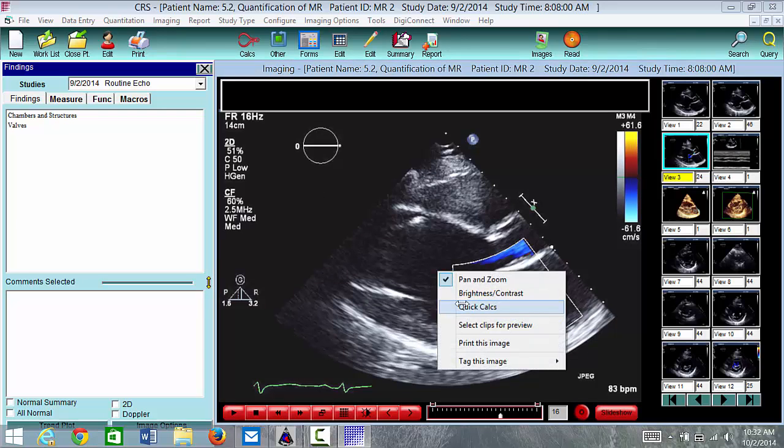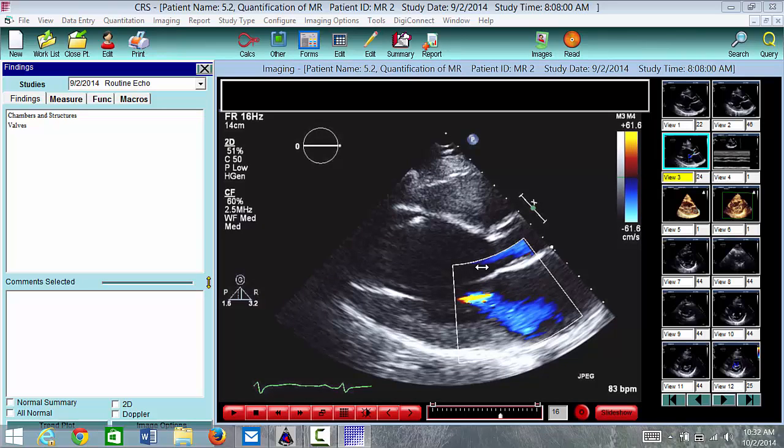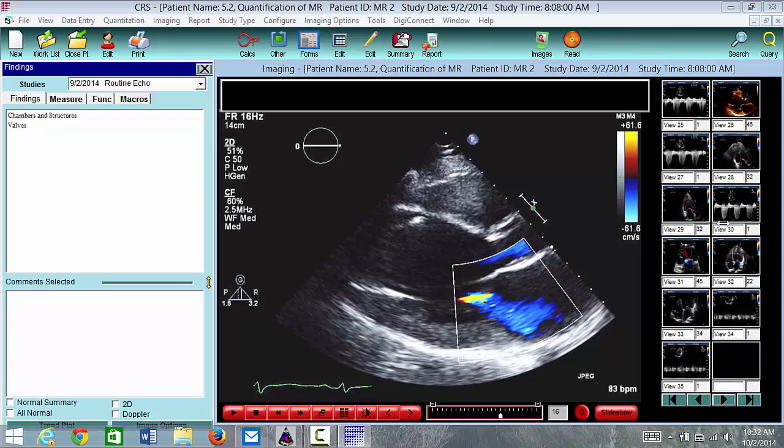Hold on, quick calcs, calc, 2D. Here we go. There we go. And let's review this in the apical view.